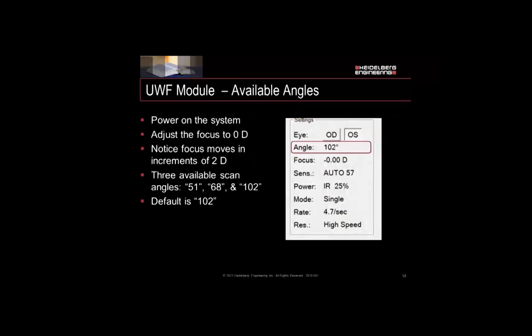After the lens is on and everything's lined up, power the system back on. You'll notice your settings are a little different on both the touch panel and the screen. Adjust your focus to zero — you'll notice it no longer moves in quarter increments but instead moves in increments of about two diopters. On your touch panel, you'll also see three new angles available: 51, 68, and 102 degrees. 102 degrees is going to be the default image for your system.